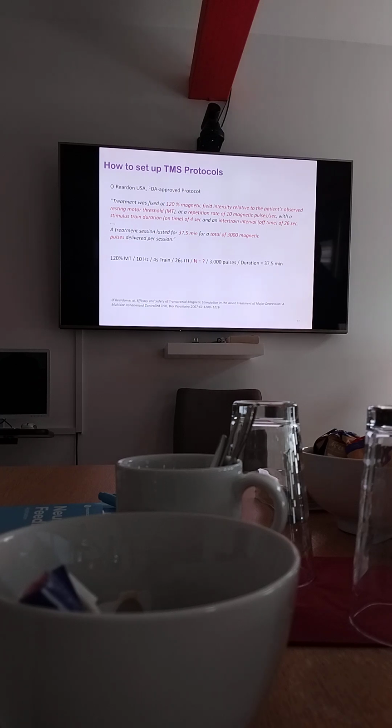If you find out after 3 or 4 sessions that there is no positive feedback whatsoever from the patient, you have some options. You could change the site, because that's possible. You could stimulate here or here. This is the first thing I would do, change the site and give it 2 or 3 more tries. It's not working on every patient.